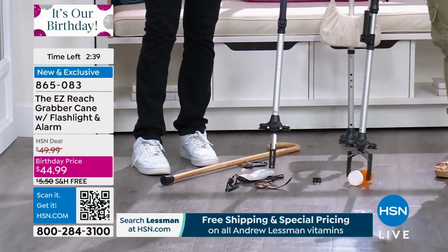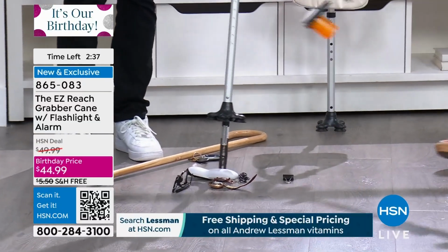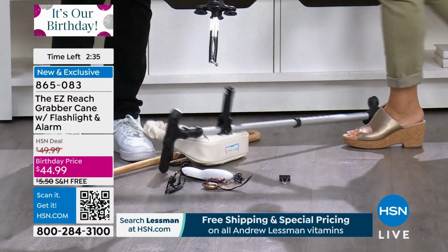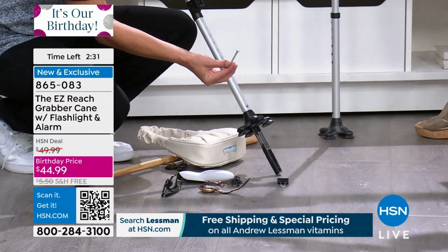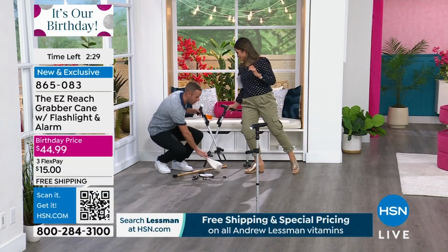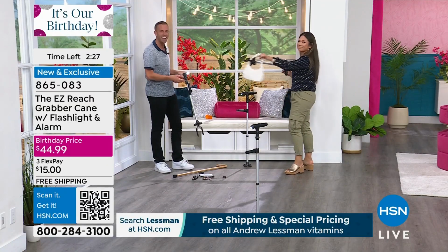Now it does have 2 magnets that are at the bottom of that grabber. I just knocked that over. I did that. That was me trying to be fancy. And so that little screw right there was what I was picking up with that. Okay, you could pick up your purse. Got it. Got it, everybody.